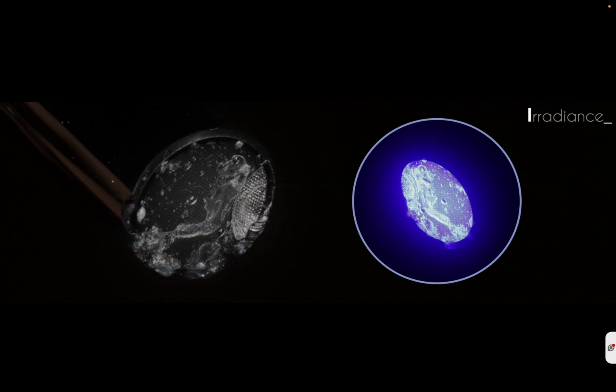And also an important thing is to have a good light cure unit, and to keep it clean, just to guarantee the best possible polymerization of the material.